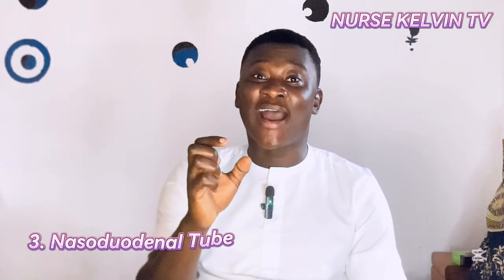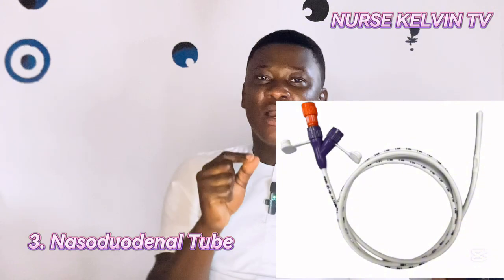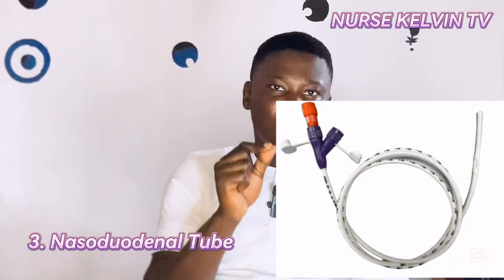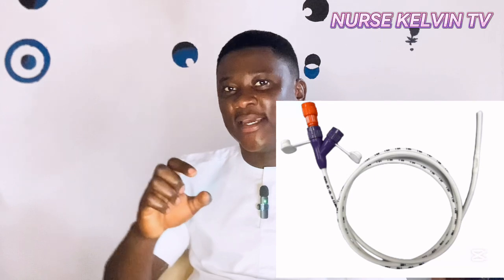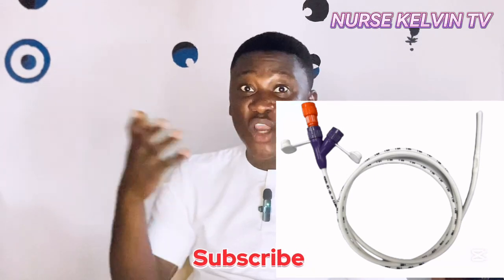And the next one that we are also going to talk about is the nasoduodenal tube. The nasoduodenal tube is used for patients who are suffering from a severe or high risk of aspiration. So when there is a high risk of aspiration or delayed gastric emptying, that's when we insert the nasoduodenal tube to help them.